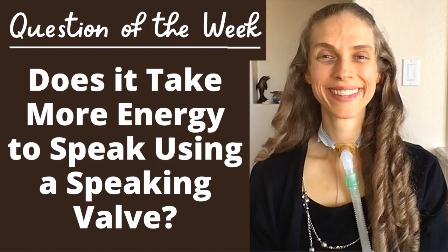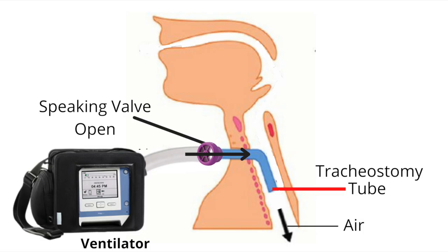In last week's video, I discussed using a speaking valve without a ventilator. This week, I will answer the question in terms of a person using a ventilator. If the speaking valve is being used with a ventilator, there is not a clear answer if it takes more energy to speak using a speaking valve. Let me explain. Remember, the speaking valve is a one-way valve.